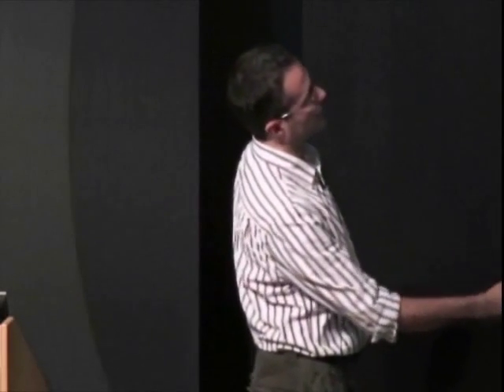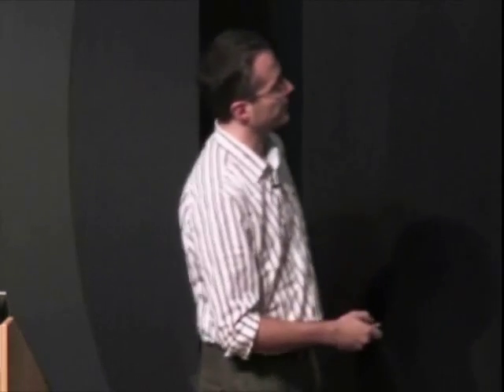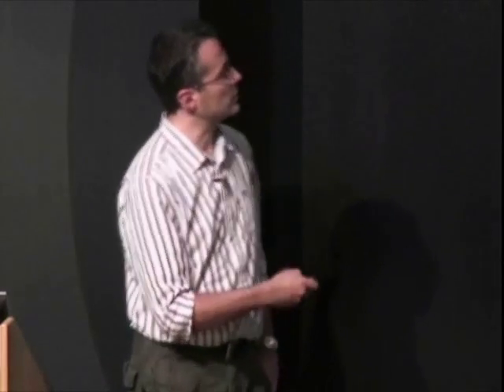This is the ground truth segmentation. So this is the gold standard. This is what we would like to achieve, what the expert has told us where the different tissue types are for each voxel. And these are the results we get using our forest-based technique. So you see that they're different, but they're not too different. So it's a very, very encouraging result. Despite the fact that the tumor has a very different appearance, location, shape, and a lot of variability in the actual size and age of the patient, the system still manages to do a very, very good job, completely automatically.